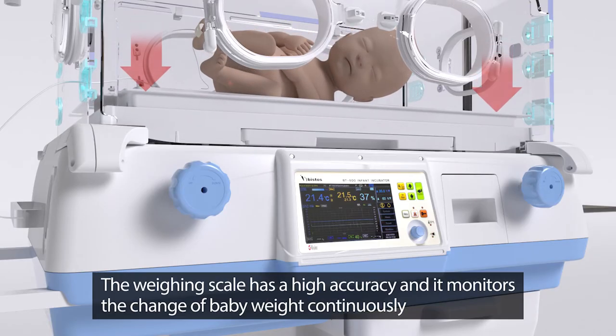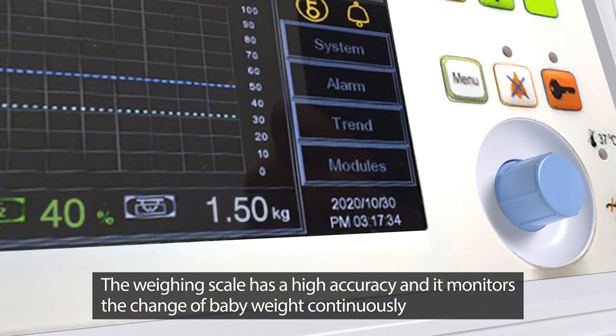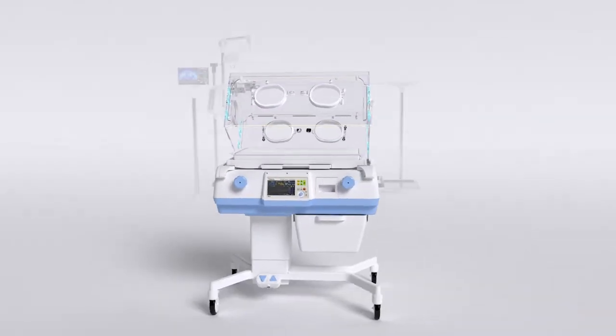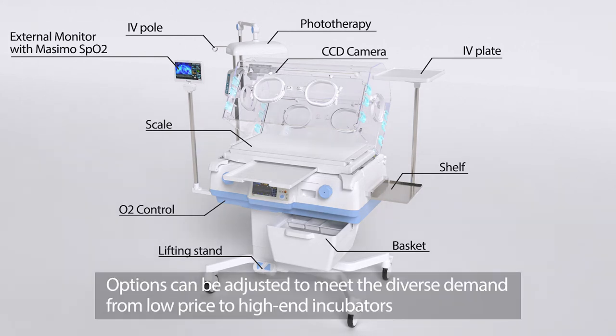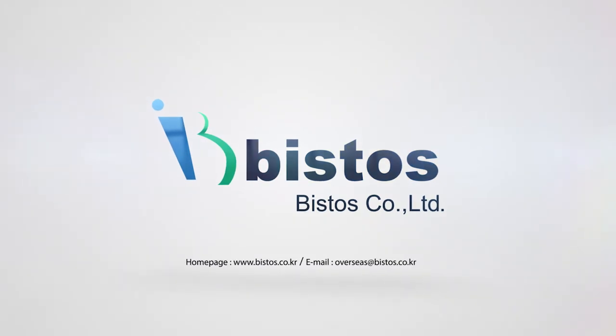The weighing scale has high accuracy and monitors the change of baby weight continuously. Options can be adjusted to meet diverse demands, from low-price to high-end incubators. Infant Incubator BT500 — Bistos, Korea.